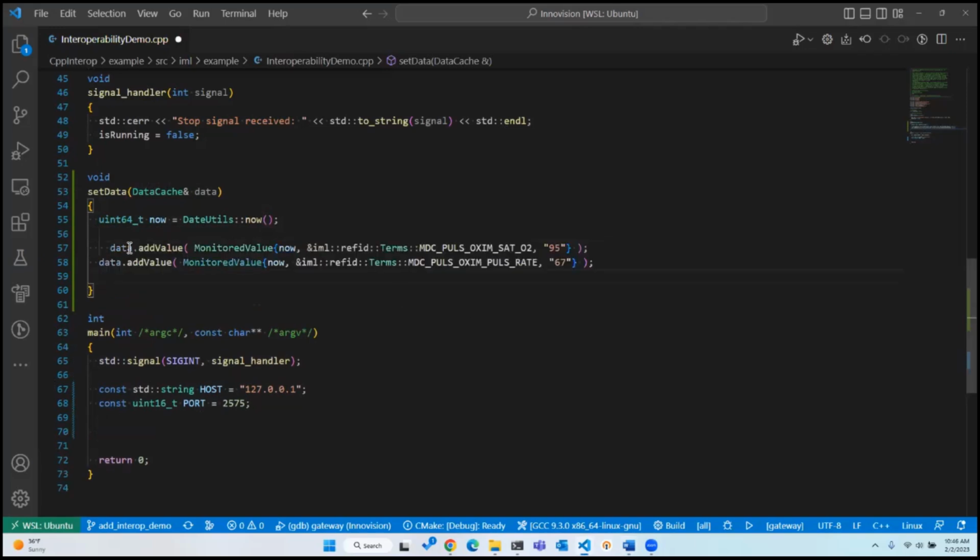So I'm now going to paste in here our two values. So here, the oxygen saturation, I've set it to 95. And we're just adding a value to the data cache, creating it a monitored value, like I said, measurement, setting, and mode. And then here is the pulse rate, which I've set to be 67. These are static for the purpose of this demo, but this just represents the data coming from your medical device. So our library supports IHE PCD harmonized Rosetta and also allows for private terms mapping as well if that's needed.